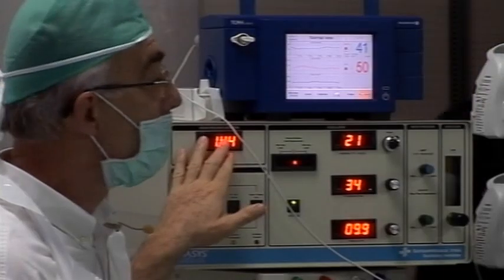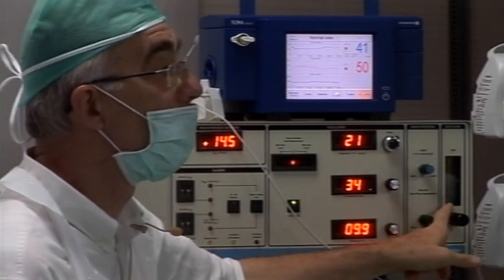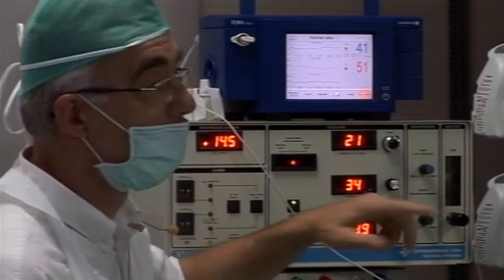We like that very much, 99 of saturation. Decrease more CDP. Okay, let's go down to 14. Why do you decrease CDP by decreasing bias flow? You're right. At this point, I could decrease here. Around 15, if you have to decrease your CDP, you have to work on flow if you have started with 10 liters. So you're right. Now that I'm at 15, I can start to use this button. You're fully right.